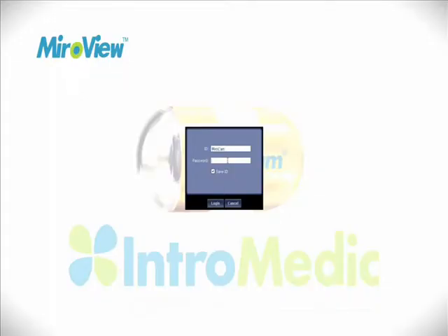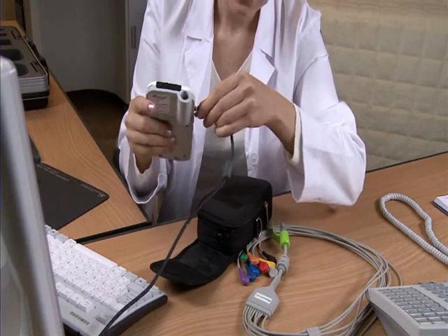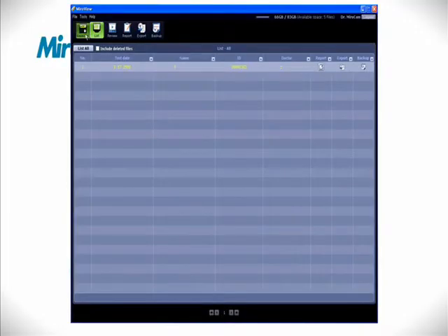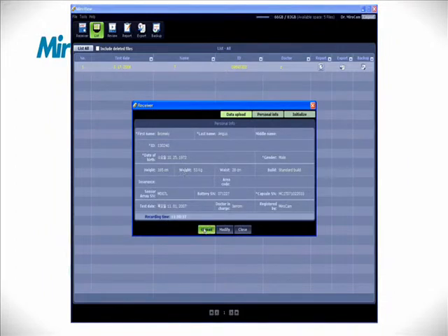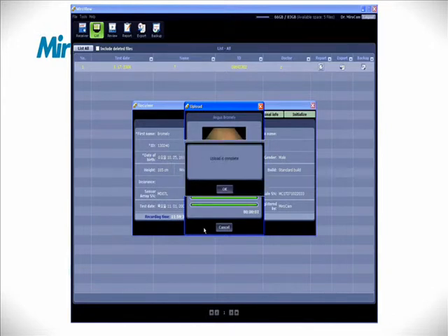After turning on the computer, start MiroView and log in. Connect the receiver to the computer via the USB cable. The receiver unit's power must be turned on. In MiroView, click on the receiver icon and the receiver window will appear. Click the Upload button, and when the progress bar is full and the complete message appears, the upload is complete.